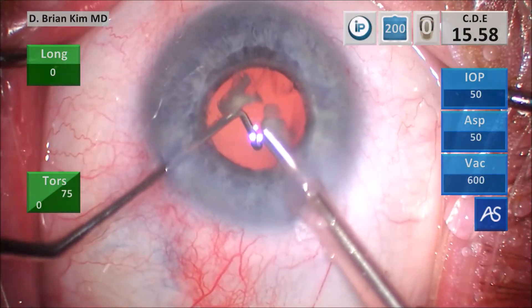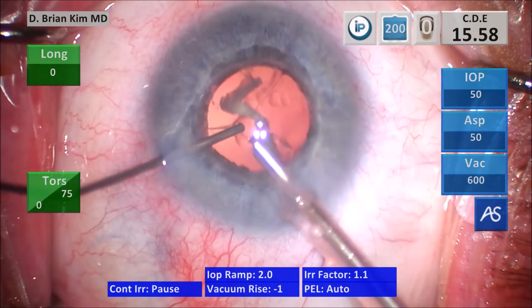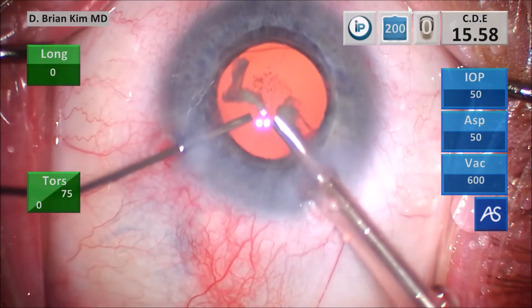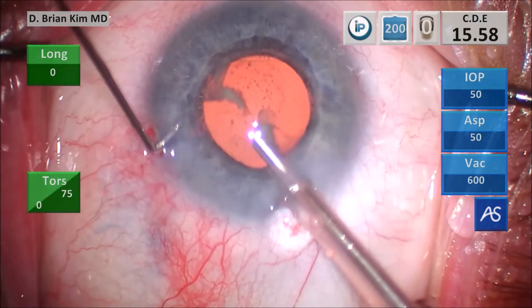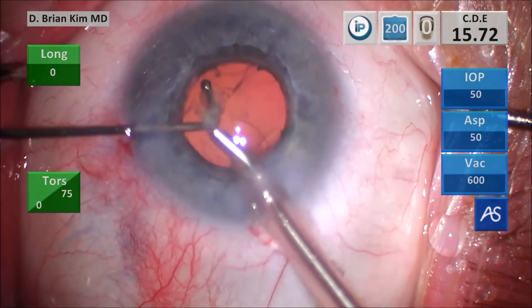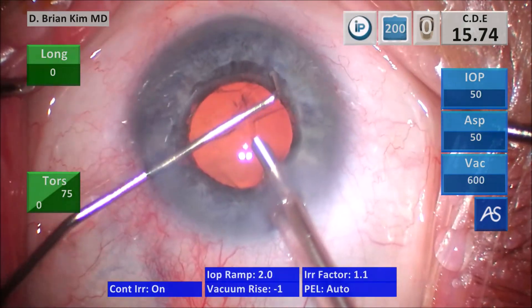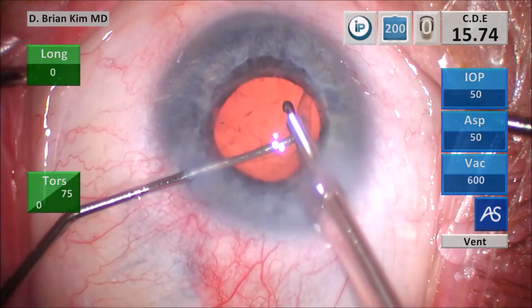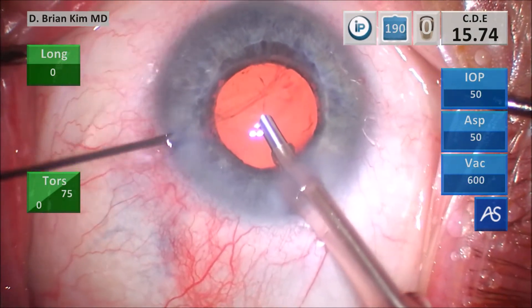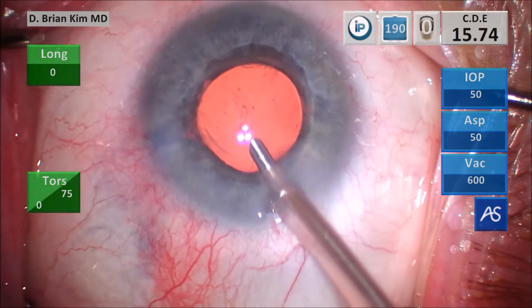This last piece — I fractured it but it flew towards the hole, and that's because there's no viscoelastic. When you see pieces moving very fast in the anterior chamber that means you don't have viscoelastic — that's another telltale sign. I stop and push more viscoelastic to plug up the hole. These are just small pieces but the last thing I would want is for them to fly into the vitreous space. I keep the chopper deep and very carefully bring the phaco tip right up to that piece and eat it. Bringing the piece right to the port of the phaco tip gives you a better chance of eating the piece before you eat the OVD. Now that I'm done, I take the chopper out, push more viscoelastic in, push the posterior capsule back, plug up the hole, and make sure there's no vitreous in the anterior chamber.